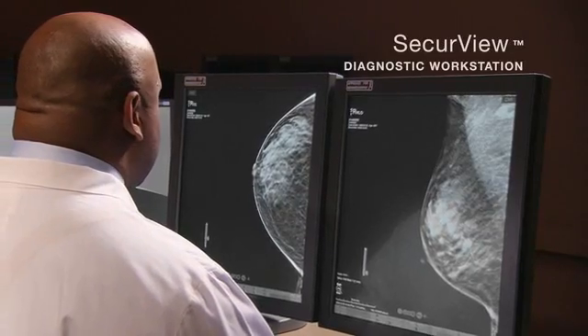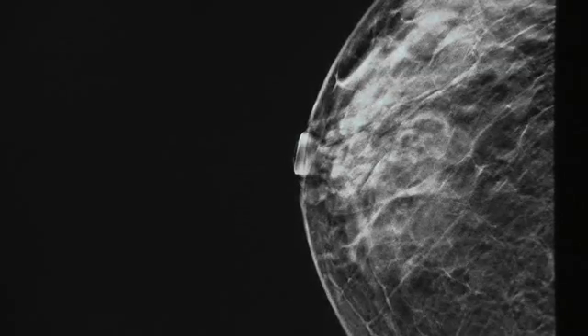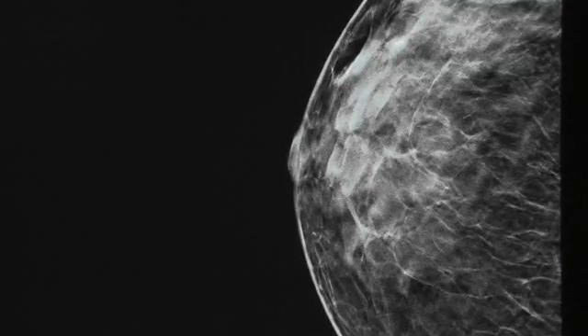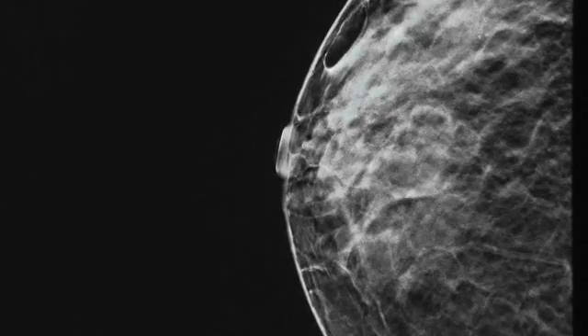The radiologist can examine both 2D and 3D studies with an upgraded SecureView diagnostic workstation. Instead of viewing all the tissues at a glance, the physician can move through the tissue layer by layer, clearly revealing details that might otherwise be obscured.